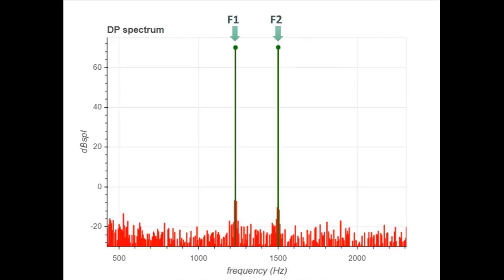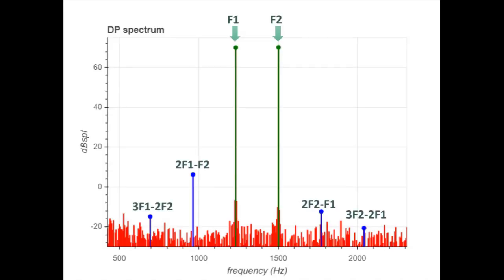And that is not the whole picture, because of the imperfections in the amplification process, where those two tones were present, my ear actually introduced some distortion. And so the blue lines have been generated by my cochlea, and they are all mathematically related to the frequencies of the tones that we put in.